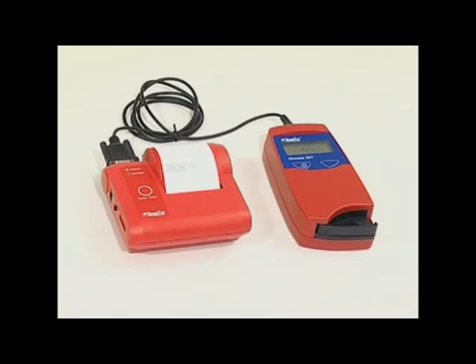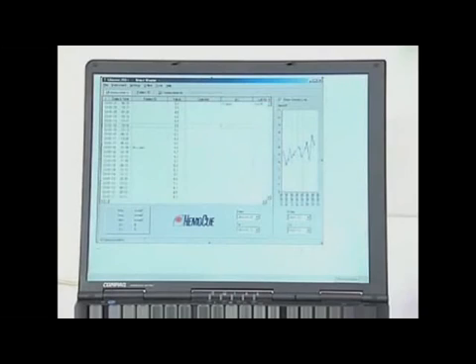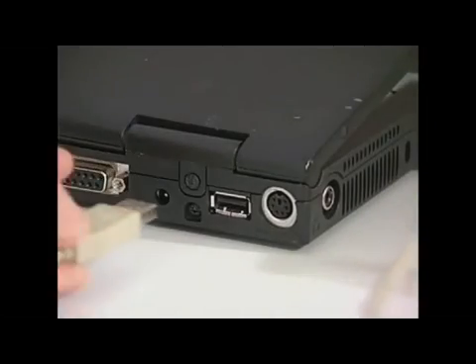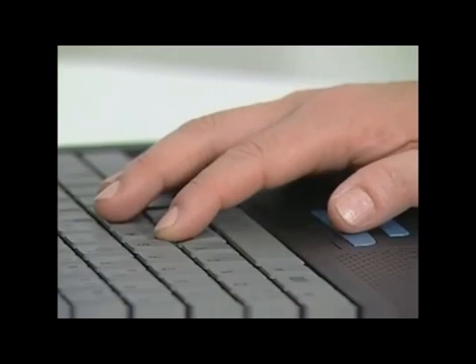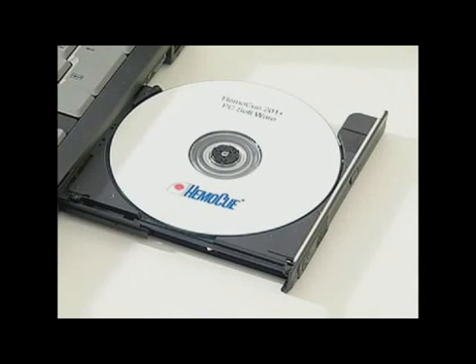Only use ASCII printers recommended by Hemacue. Stored results can be downloaded to a PC for further analysis or storage. With the help of the Hemacue to A1 Plus PC software, all or selected data can be viewed in tables or graphs. To download data, connect the analyzer to the PC using either the serial or USB port located at the back of the analyzer. For further information on how to download and review data, please refer to the operating manual for the Hemacue to A1 Plus PC software.